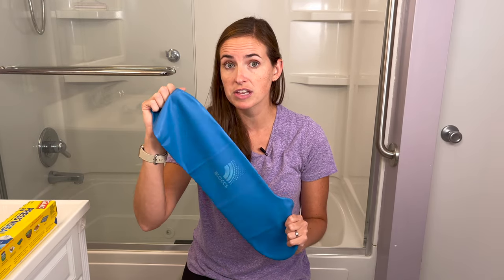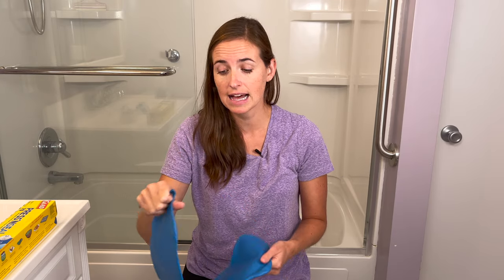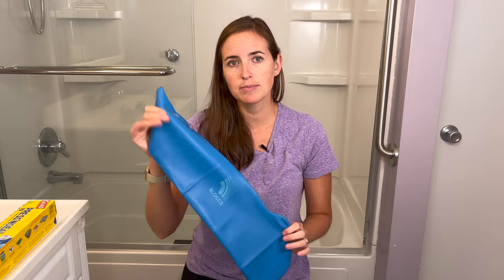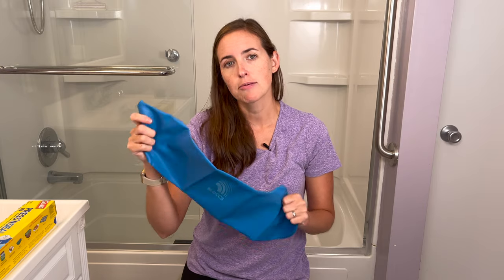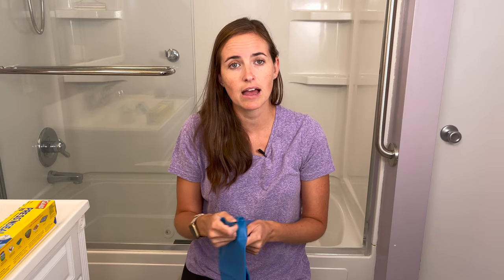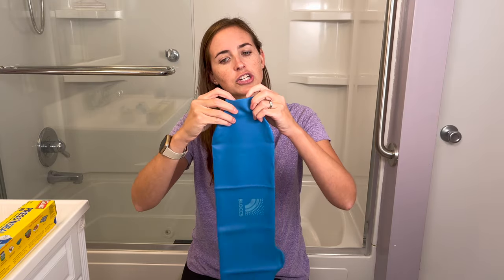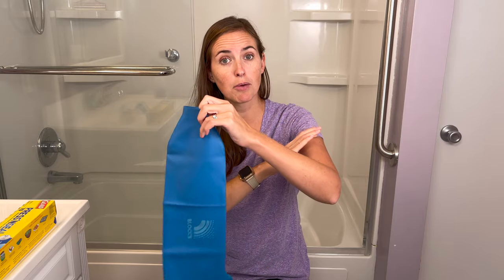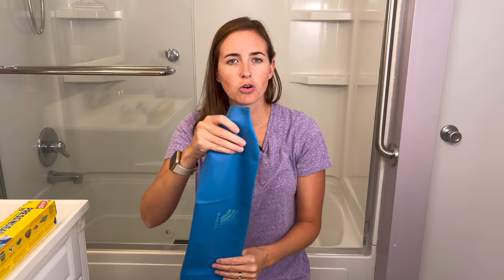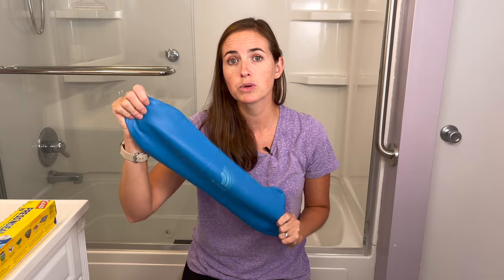One very important note: this cast cover is made of latex rubber, so if you have a latex allergy or a concern about one, this product will not be appropriate for you. Overall it's a wonderful product that keeps the cast completely dry with excellent peace of mind. About two weeks into her recovery, this is our go-to because her pain is completely managed and the jostling of putting it on no longer bothers her. The one thing she notices is the tightness of the seal around the upper arm — it can be a little pinchy when applying it, so just be aware.